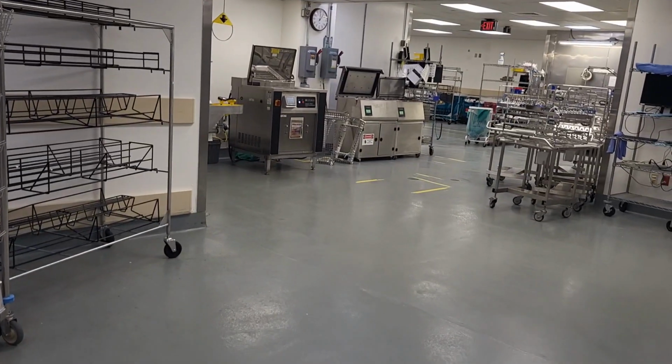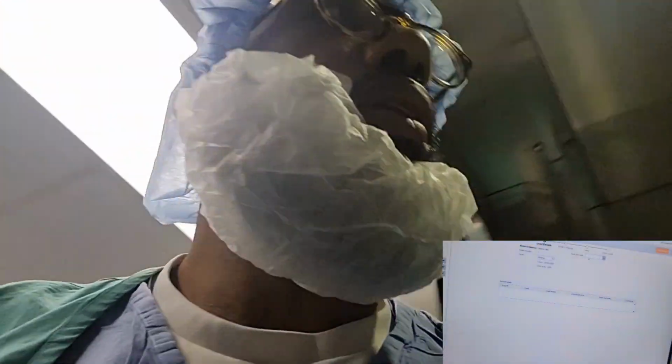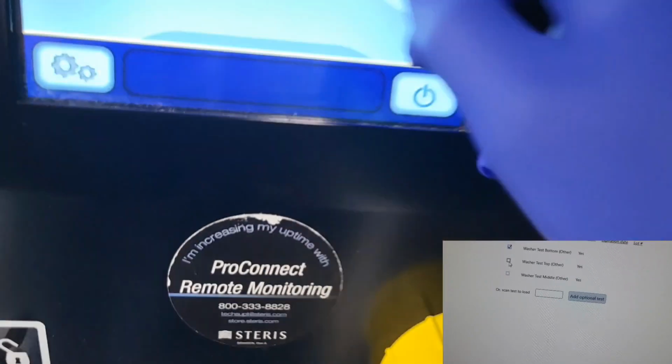Gonna do the car wash, gonna do the ultrasonic, we're gonna do the washers as well, four of them. We're gonna go through it. This is on a computer setting, so we have to write it down in the computer that the test was done and if it is passed as well. So let's get into it.